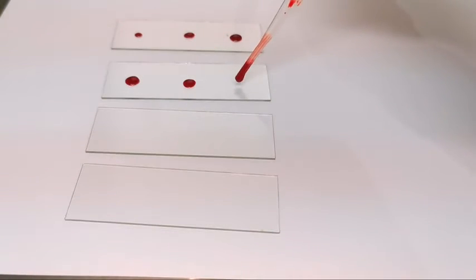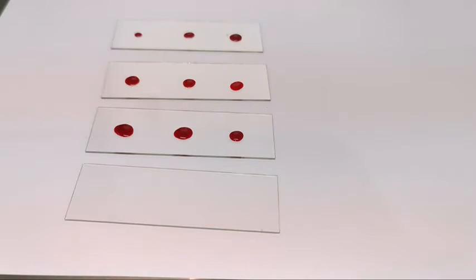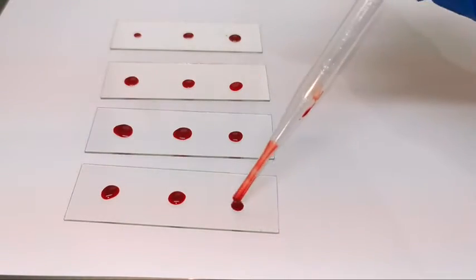Put 3 drops of blood in the slide. Use 1 slide for each patient. Patient 1. Patient 2. Patient 3. Patient 4.